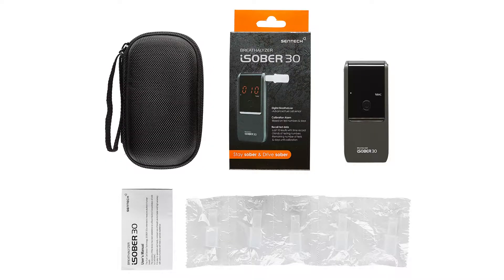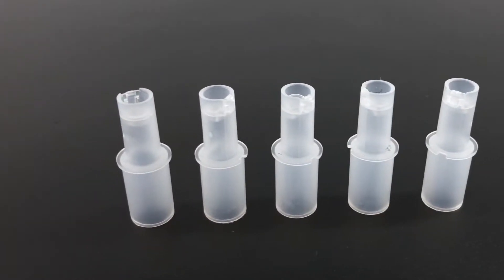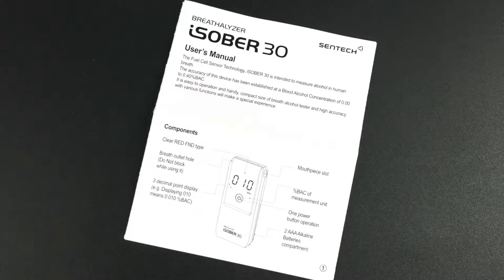In the box, you'll find your iSober 30 breathalyzer, five disposable mouthpieces, two AAA alkaline batteries, our stylish zipper case, and your user manual.